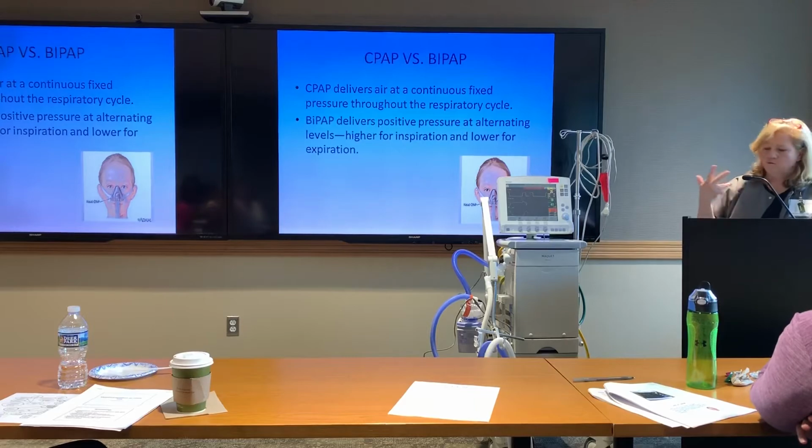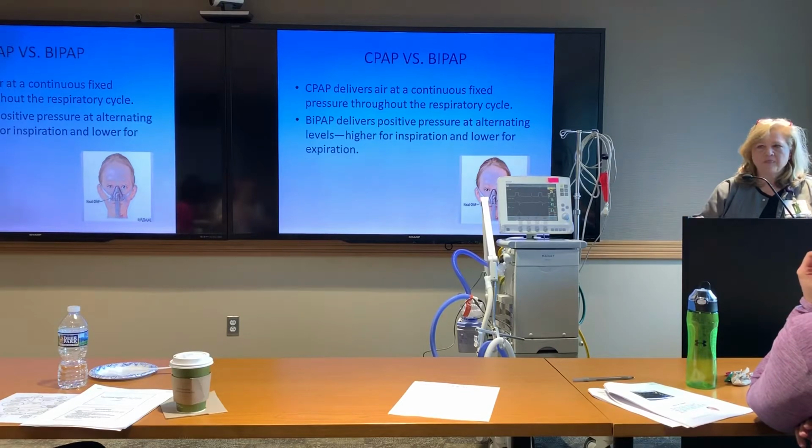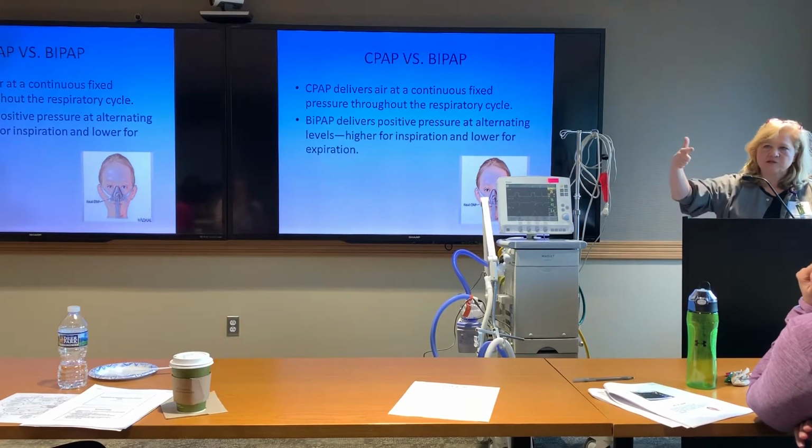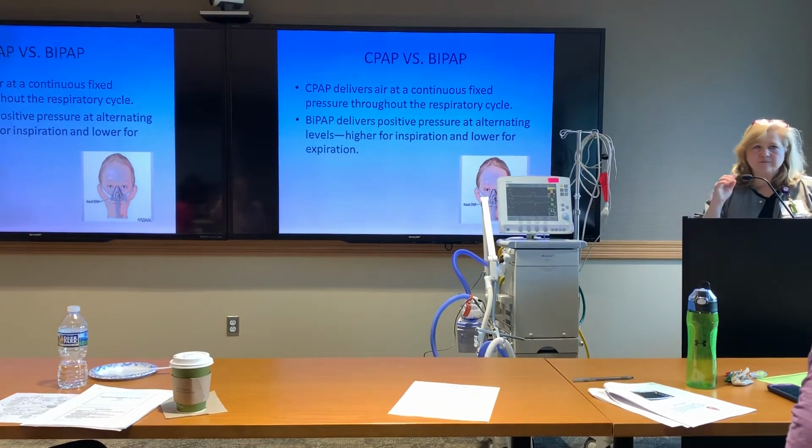All right, so BiPAP is like pressure support, only non-invasive. Okay, I set a pressure level that when I'm doing BiPAP, I don't call it pressure support, I call it IPAP. Okay, it's the same thing. IPAP and pressure support are effectively the same thing. Numerically, they're different, but I'm not worried about that.